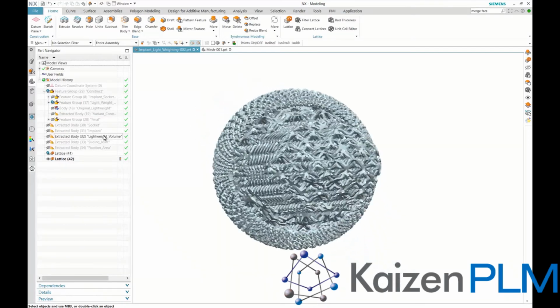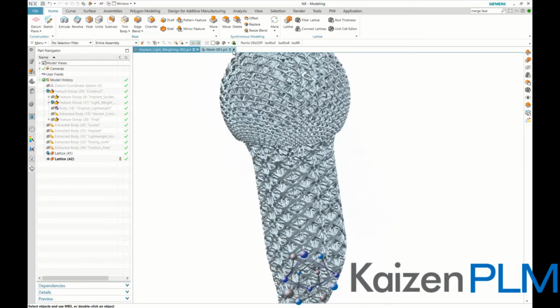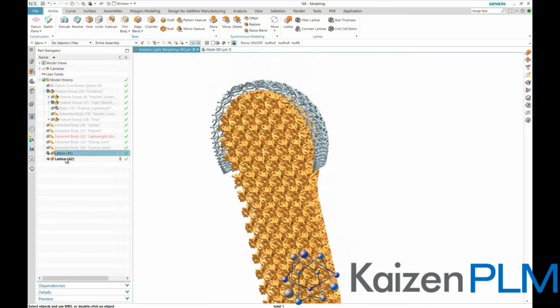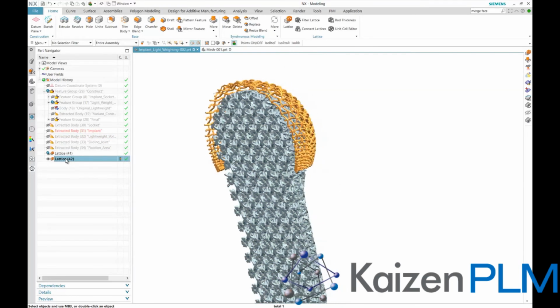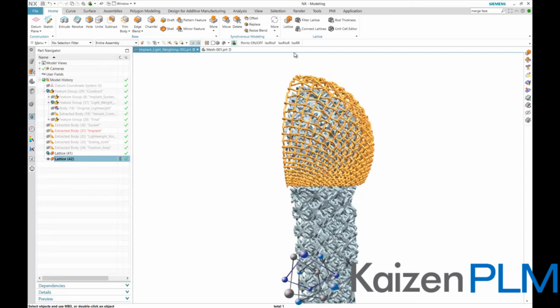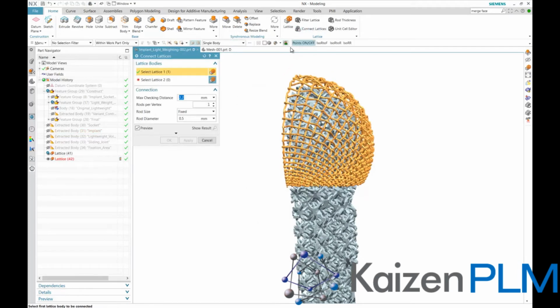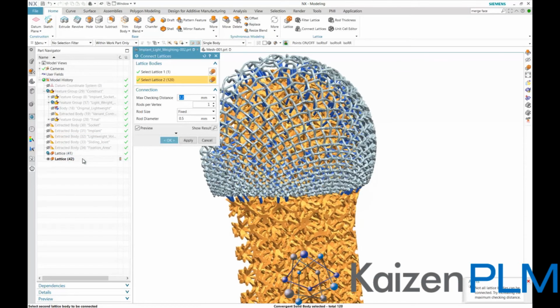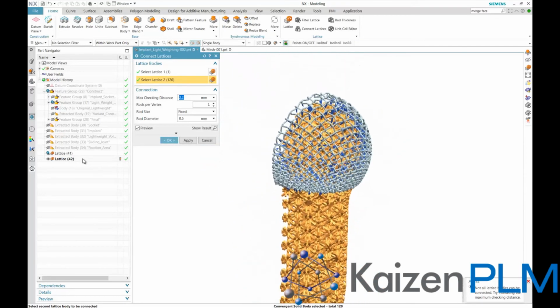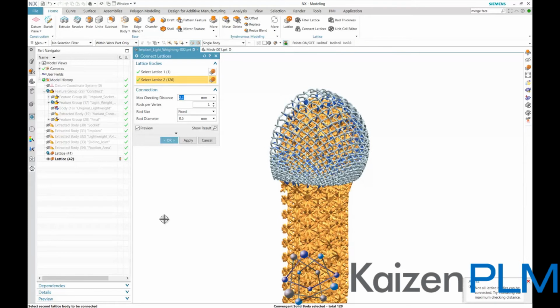As the inner and outer lattices now follow each other in the ball area where we intend to connect them, we have a great setup to use connect lattices. We select the two lattices to be connected and set the appropriate parameters in the feature menu. Increasing the checking distance here would of course increase the number of connection points between the lattices. Adjust the checking distance value to best fit your purpose.